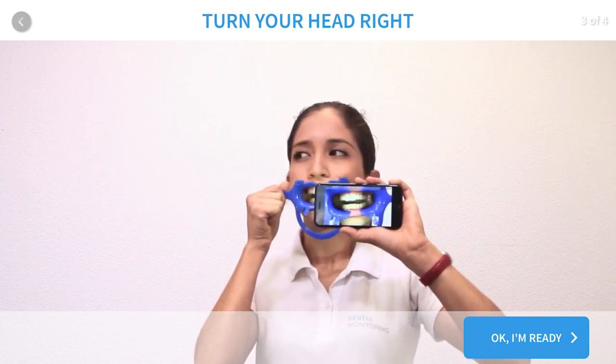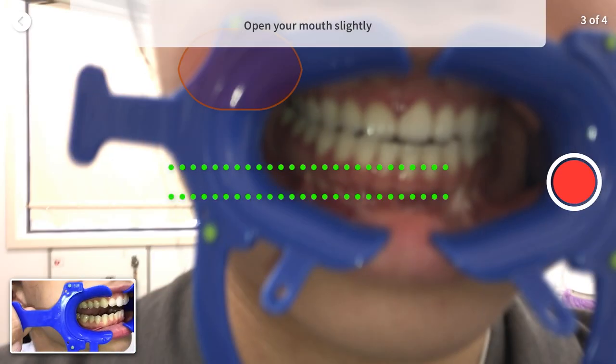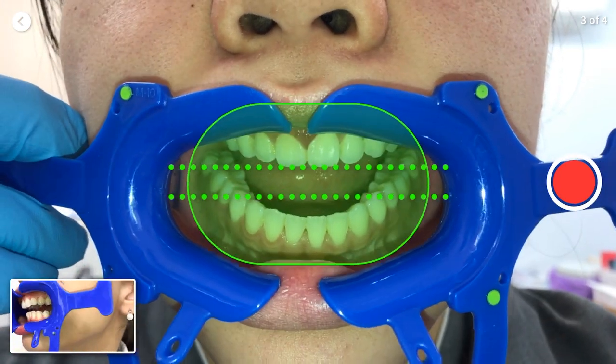The third scan is very similar to the first one, but just without your aligners. Click OK and ready to start. Open your mouth slightly, just about a finger space, then click the volume button to start your scan.